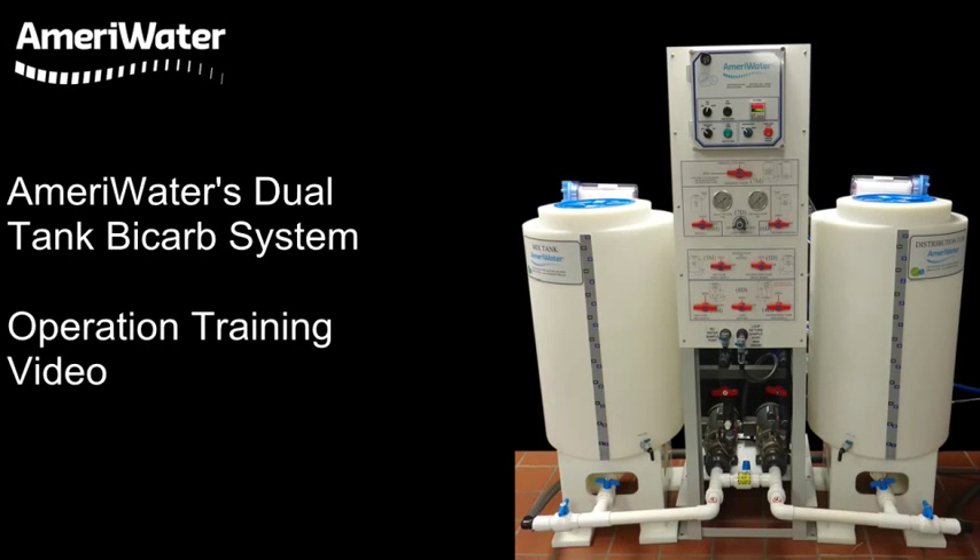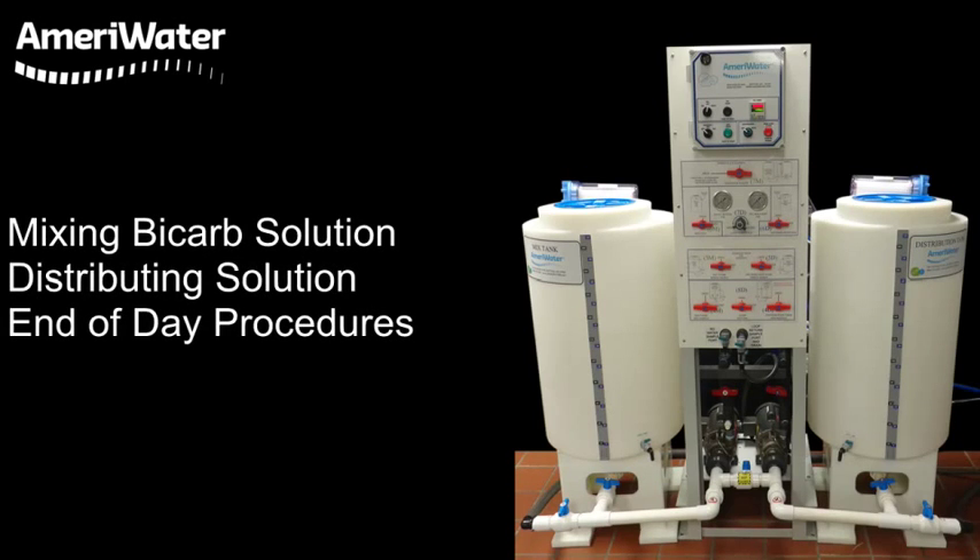Welcome to AmeriWater's operation training video for the Dual Tank Bicarb Mix and Distribution System. The three sections included in this video are mixing bicarb solution, distributing solution, and end-of-day procedures to rinse out the entire system.